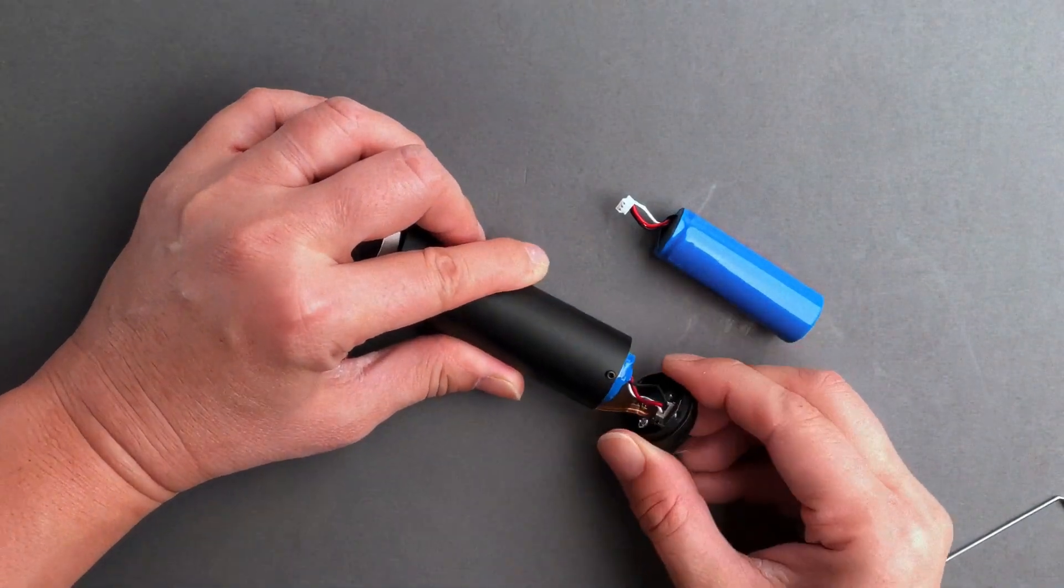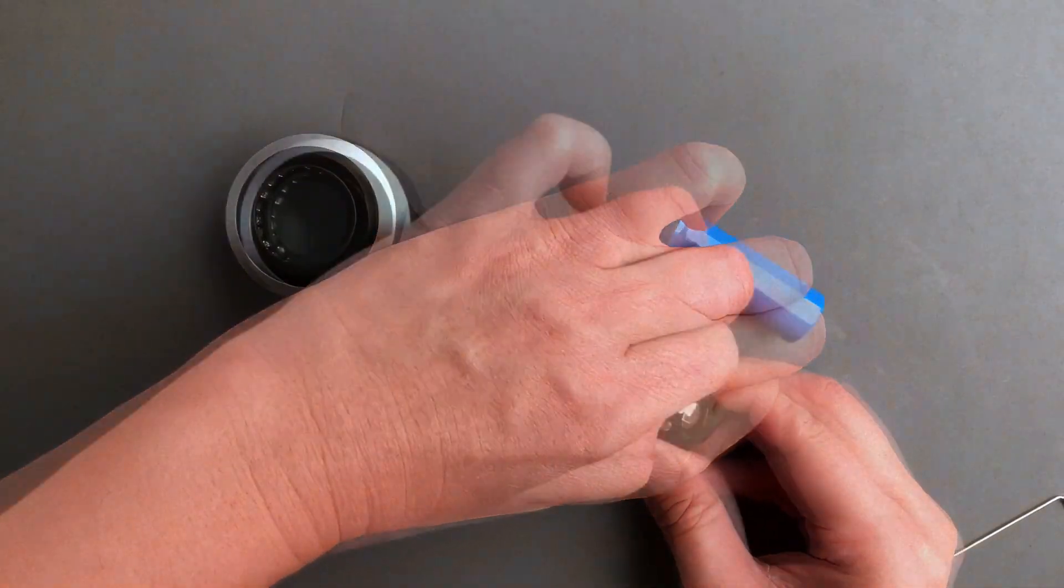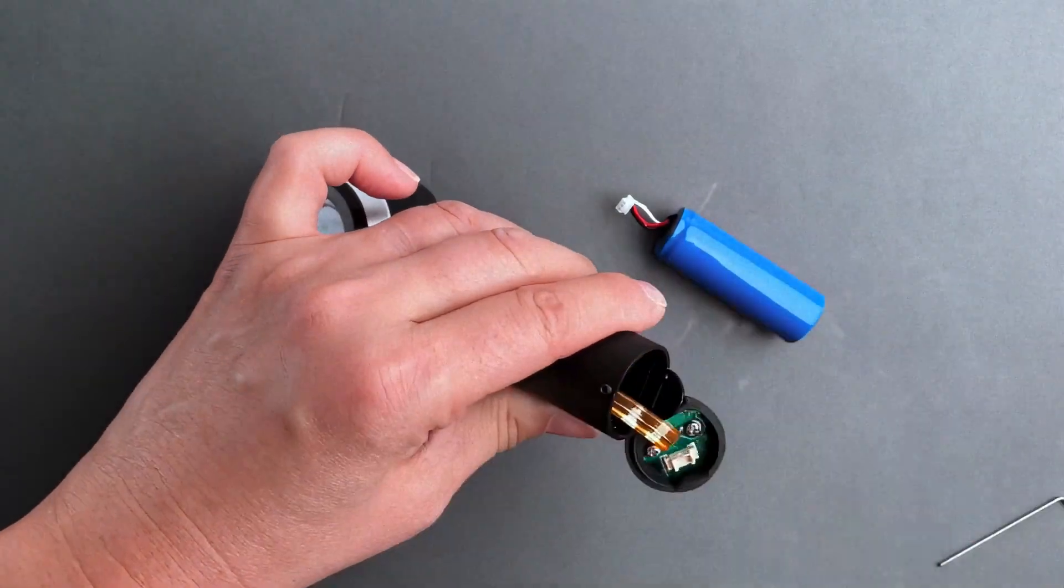Once loosened, you'll then pull the battery cap off and disconnect the white battery connector. Remove the old battery and dispose of it safely.